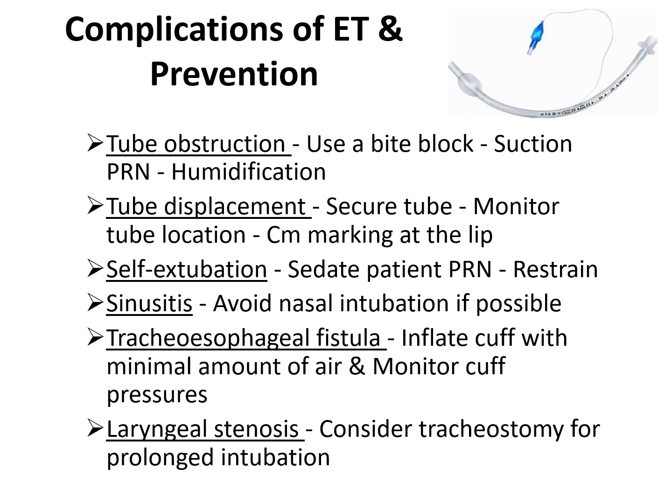Tube displacement: secure the tube with some kind of device, and absolutely monitor the tube location. So mark on a whiteboard where the centimeter mark is at the lip. On the endotracheal tube, there are markers, and you would note what number it is at the lip.